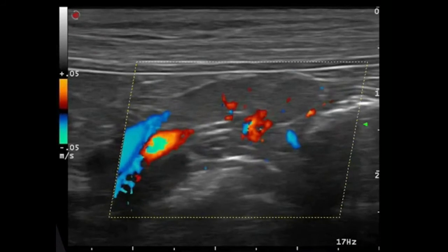Echogenicity is normally homogeneous, even though a slight hypoechogenicity can sometimes be observed at the edges, especially in young animals. Observe the vascularization at the hilum in this node, which often disappears in malignant nodes.